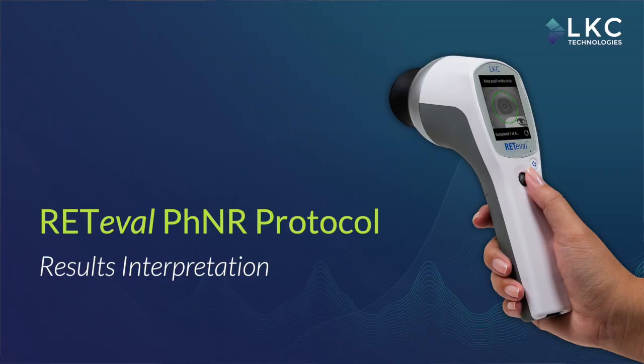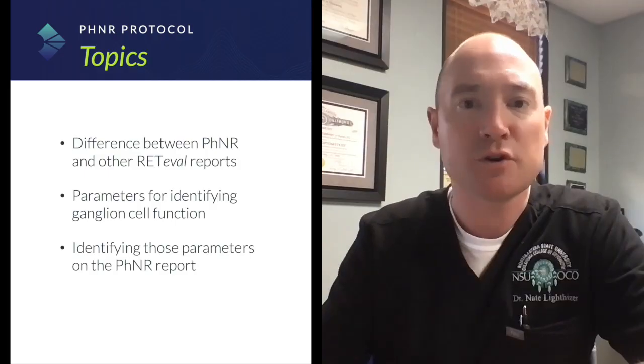Hey everyone, Dr. Nate Lighthizer here from the Oklahoma College of Optometry, talking with you today about the photopic negative response. More specifically, what is the PhNR? When is it indicated? What is it utilized? How do you interpret the reports?